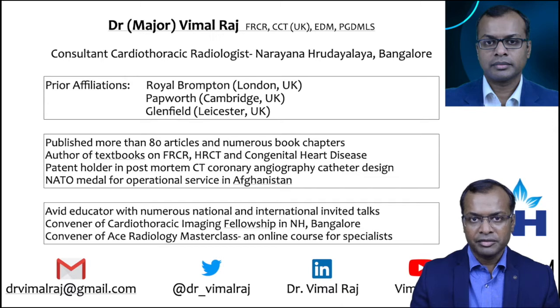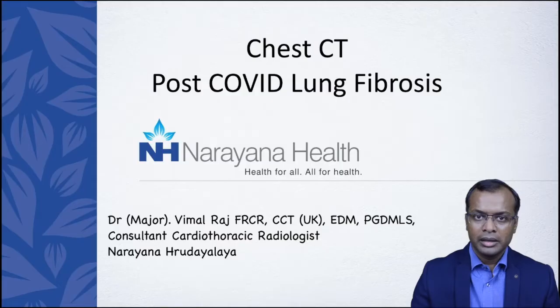I am Dr. Major Vimal Raj. I'm a consultant cardiothoracic radiologist. I head the unit of cardiothoracic imaging in Narayana Hridayalaya, Bangalore. Today we're going to talk about chest CT and post-COVID fibrosis.